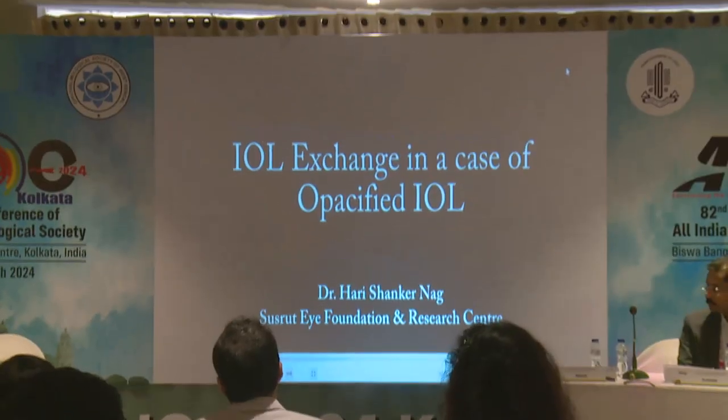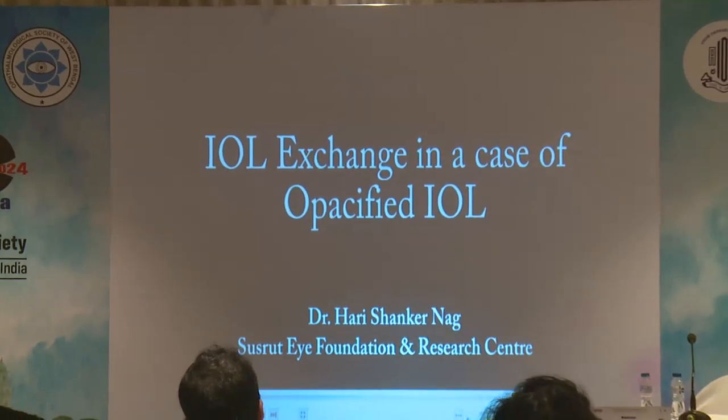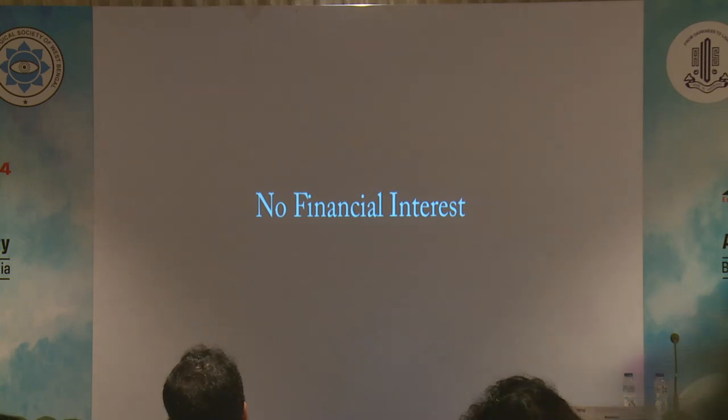Intraocular lens implantation is the standard of care for visual rehabilitation after cataract surgery. However, IOL opacification may rarely occur as a late complication and can cause significant visual impairment. In such a situation, the opacified IOL needs to be explanted and replaced with another IOL. The present video is about one such case.